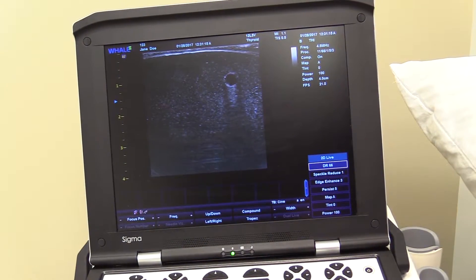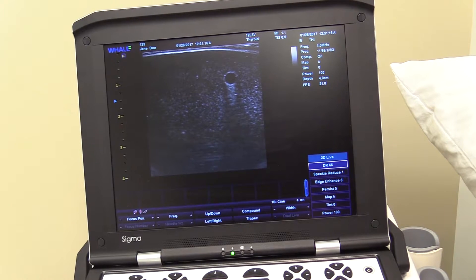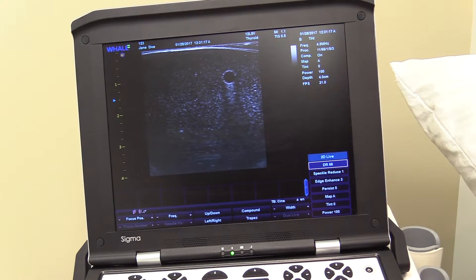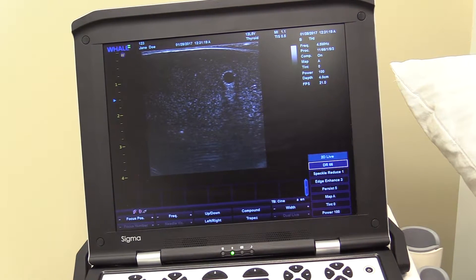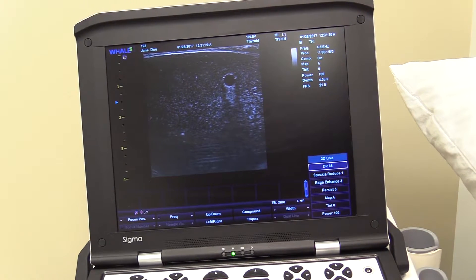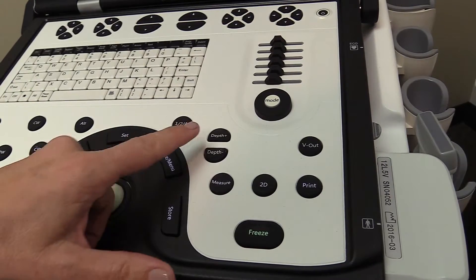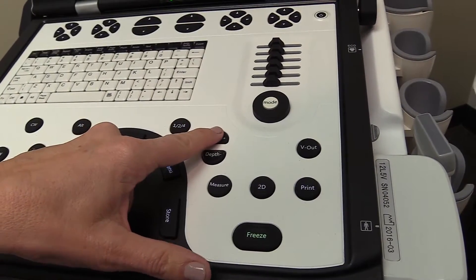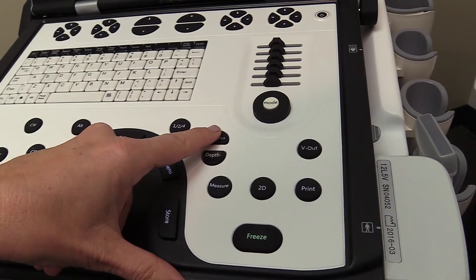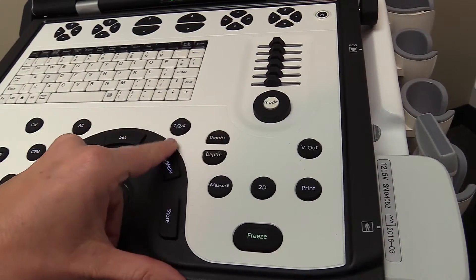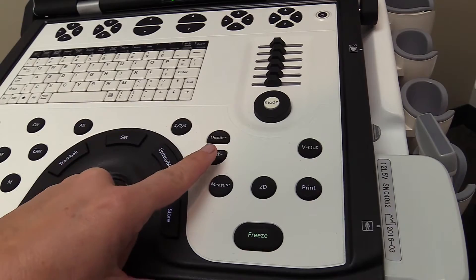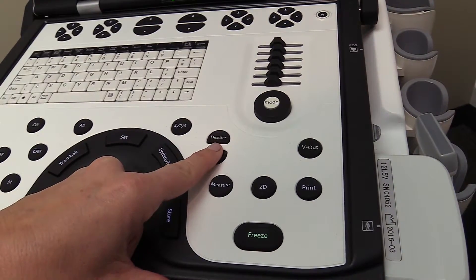Important scanning adjustments: the scanning depth. Depth may be adjusted by increasing the depth with the plus key, or decreasing with the negative depth key.